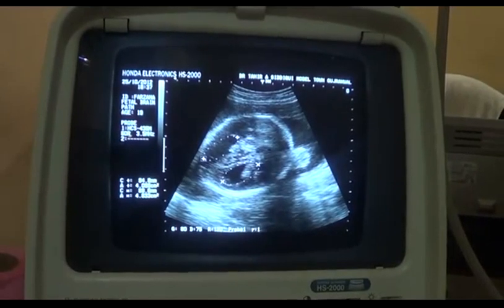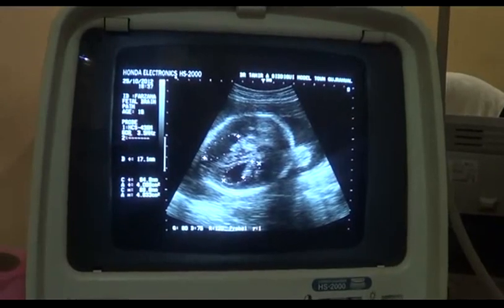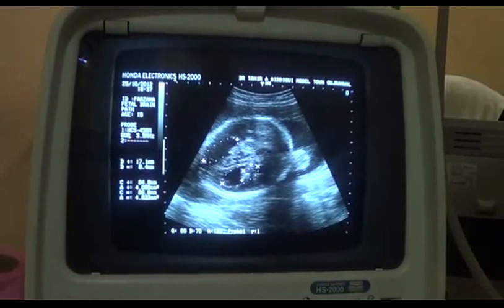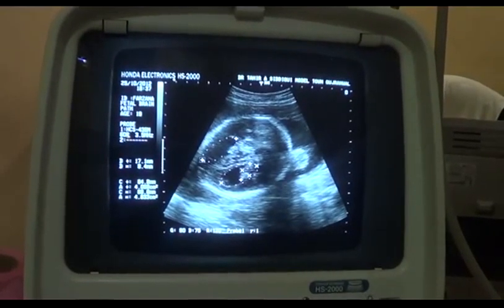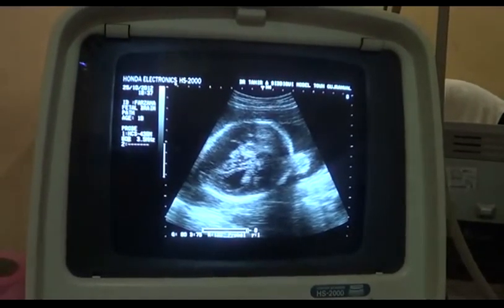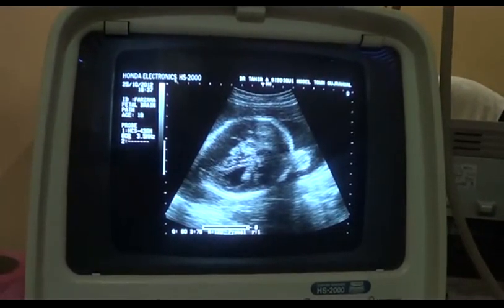And this hanging echogenic area that you are seeing is the choroid plexus, making an angle of more than 75 degrees within it. So this is a first look at this patient.